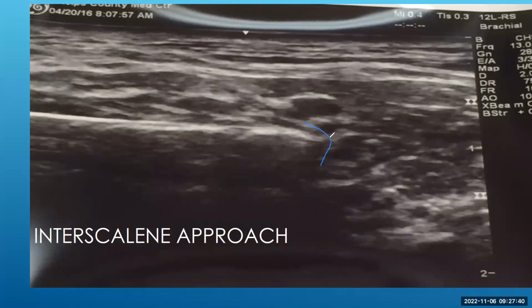We're just super close. And this is where ultrasound does have an advantage because you can actually see the anatomy that you're going for. And when I see it stretch like this, I just put steady pressure, and I put some pressure on the syringe as well, because it's a very dense structure.